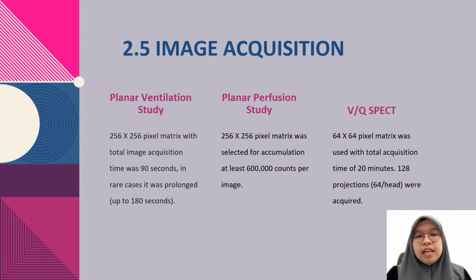For the planar perfusion study, the pixel size is also a 256 by 256 pixel matrix, and it was selected for accumulation of at least 600,000 counts per image to get the image for the planar perfusion study.